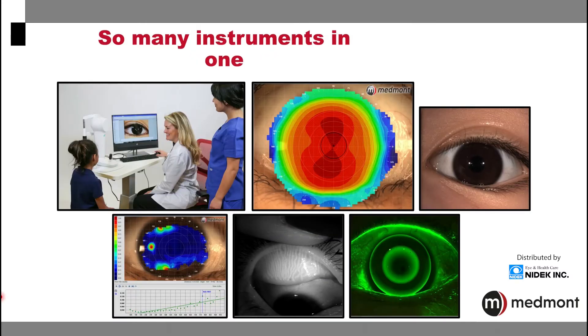The Medmont Meridia is many instruments in one. It's first and foremost a corneal topographer, but the imaging options allow it to take anterior segment white light captures, non-invasive tear film breakup time testing, meibography, as well as fluorescein assessment. With the patient behind this one single instrument, there's so many things you can do.